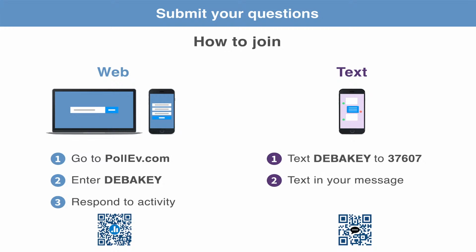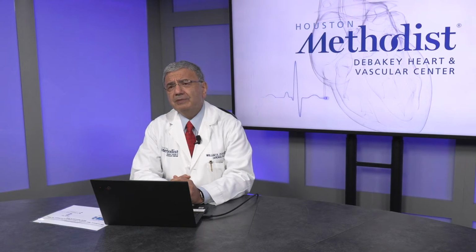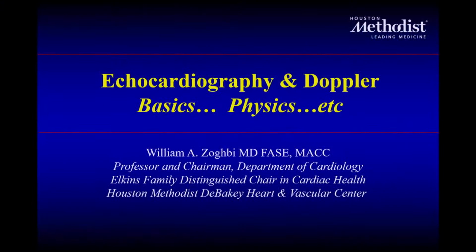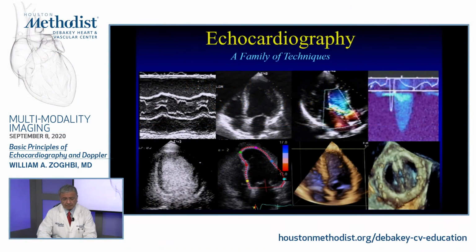So let's get started. We're going to talk today about Doppler basics and physics. I know it may be boring to some of you, but I think it's important for us to go from time to time to the basics of how the image is constituted, the evolution of echo Doppler techniques and how we use them nowadays. But mostly I think it's good to refresh ourselves as to the basics, because then we can understand the artifacts, some of the issues that we're dealing with. So I think it's a good basis for us to review together.